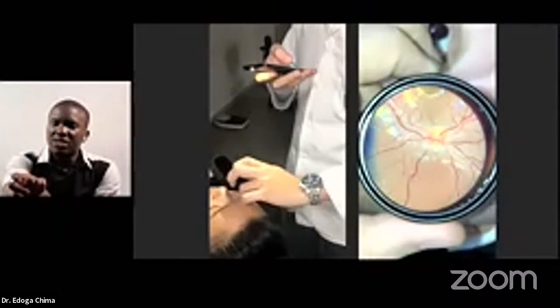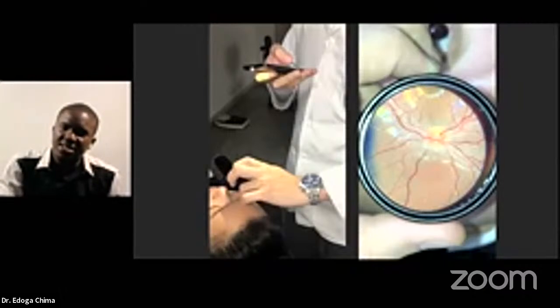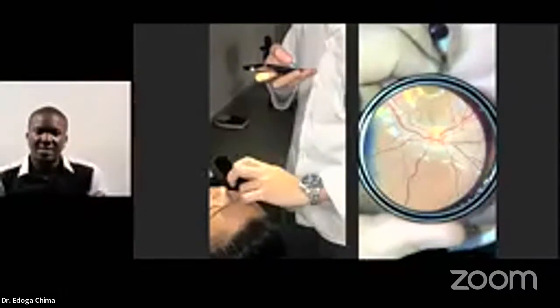If the patient is lying down and you are facing down to the patient, gravity will be removed. So you are now working with gravity and not against gravity. These are the three things that you get by positioning the patient flat on the couch.